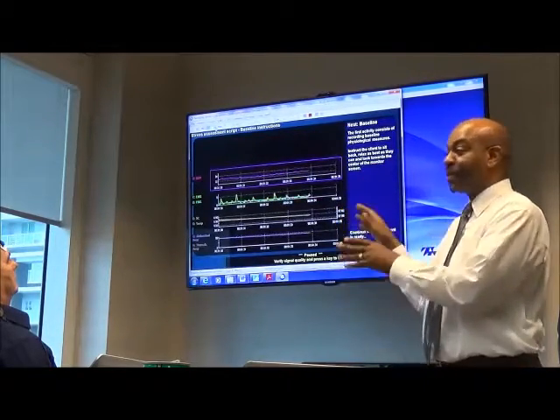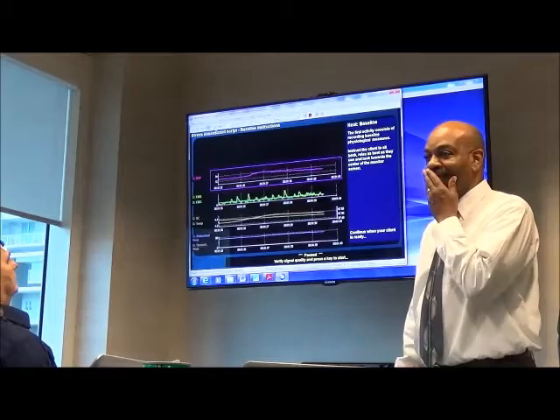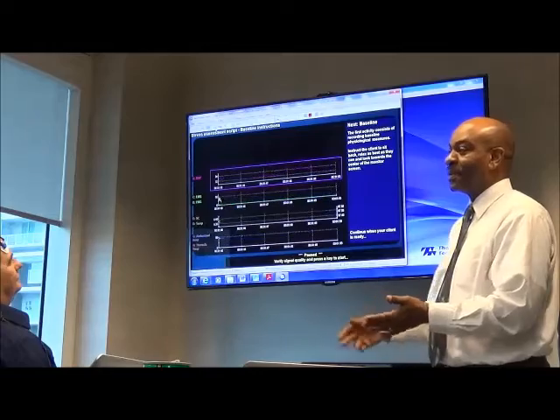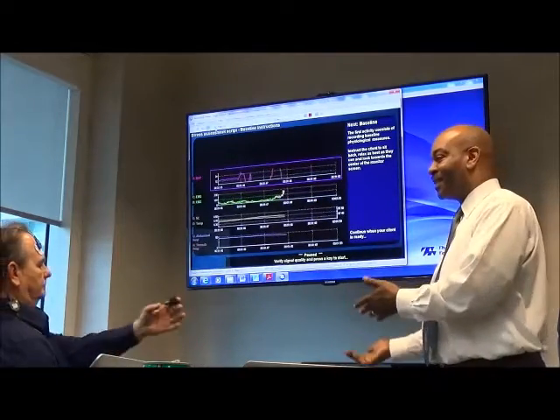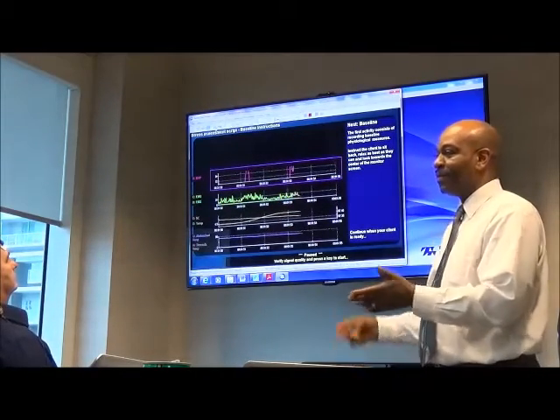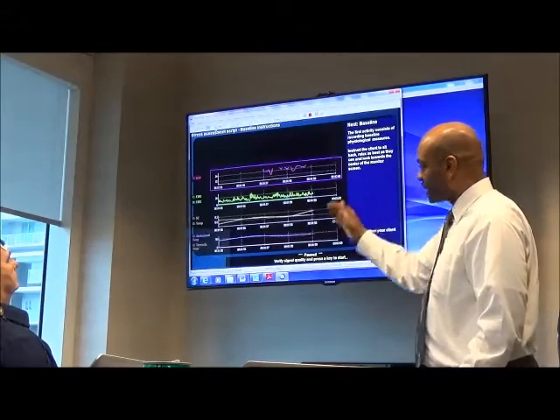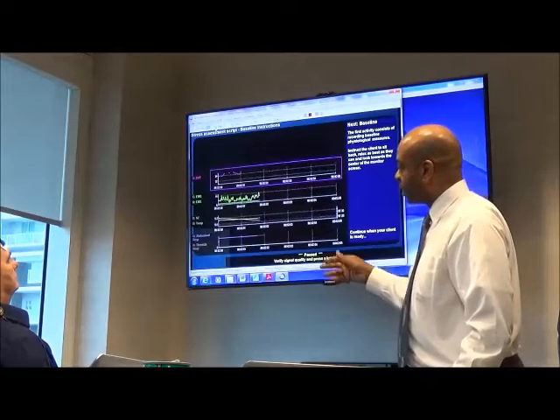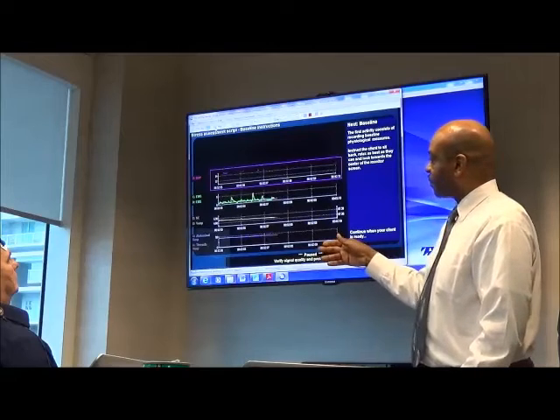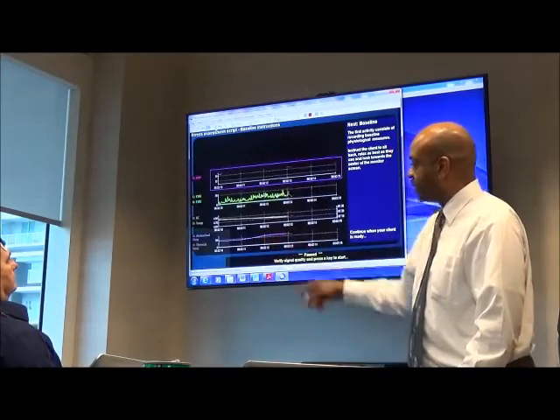So this would be the time to go back and fix that, rather than take this person through this whole assessment and say, oh my gosh, I made a mistake, I have to do it again. First of all, they just took the test, so doing this exact same thing again right away, the stressors are not really going to work that well. Their baselines are messed up, and they're frustrated because they just did it. So it's good to make sure everything is working okay. You can also do things to check to make sure there's some response. Like, I might ask him to just take a breath and see if I see a change in the respiration.